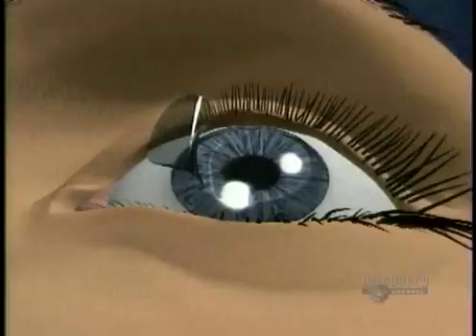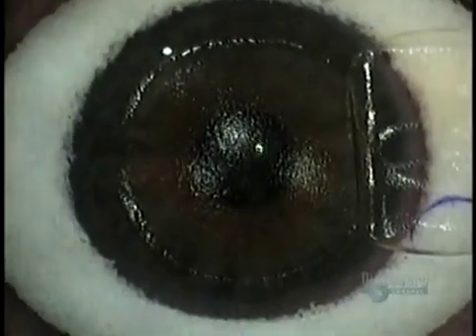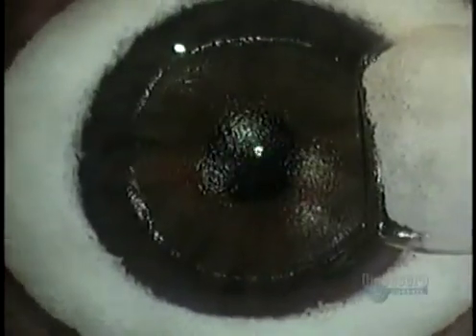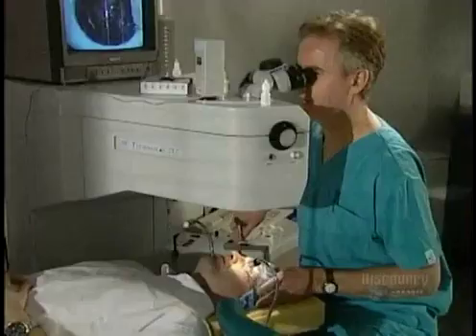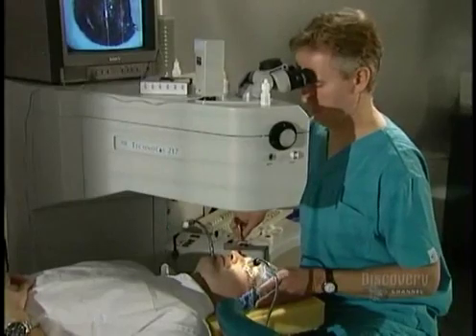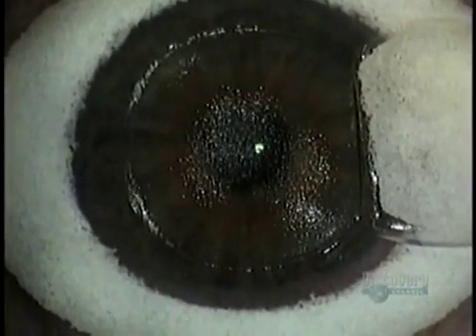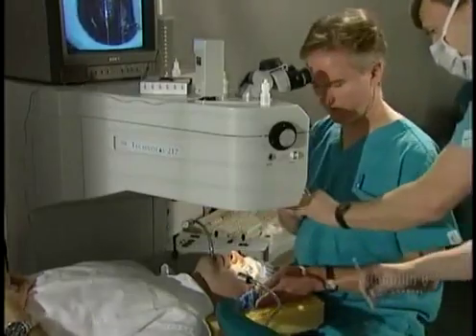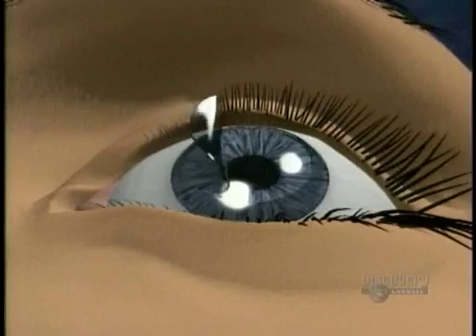He mops up the excess liquid, then starts up the laser. Meanwhile, a tiny sponge keeps the flap moist. The laser, an invisible light, fires in pulses — 50 pulses per second. Each pulse vaporizes a one-quarter micron of corneal tissue. The laser has been computer programmed beforehand, so it knows exactly how to reshape the cornea to give most patients 20-20 vision. In less than a minute, it's done.